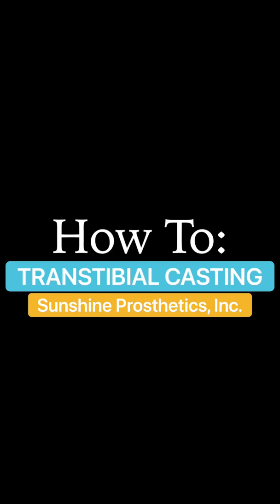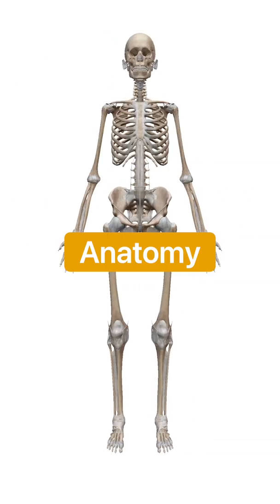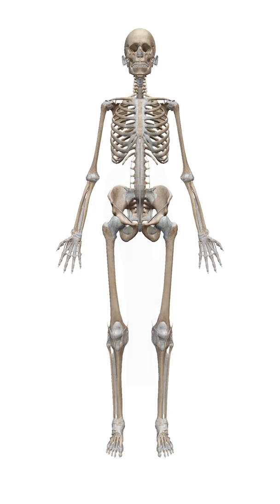Hello and welcome to the Sunshine Prosthetics transtibial casting instructional video. Today we're going to be going over an easy and straightforward transtibial casting method that will give you reliable and repeatable results. But before we do that we're going to go ahead and review a little bit of the anatomy that you need to know and be paying attention to throughout the casting process.